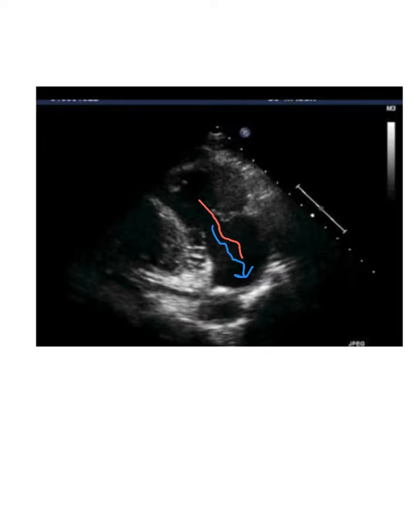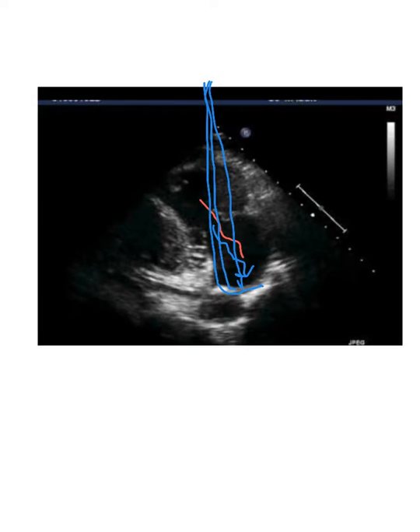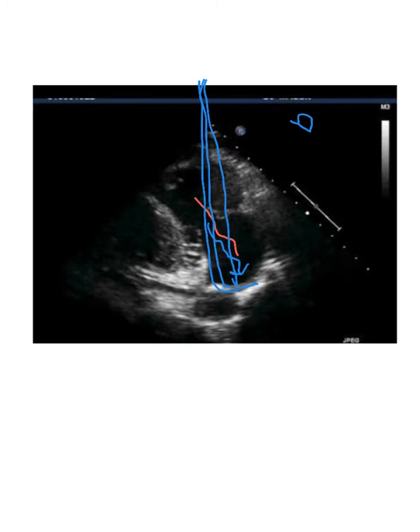So it's a great view to sample the tricuspid regurg, because sometimes the regurg will go straight towards the atrial septum or a little bit over. You want to be at no more than about a 16 degree angle. The further out you get, the worse the angle is and the less accurate the Doppler signal will be. Try to remember that when you're sampling — you want to be as parallel to flow as you can be at all times, because you want an accurate sample volume.